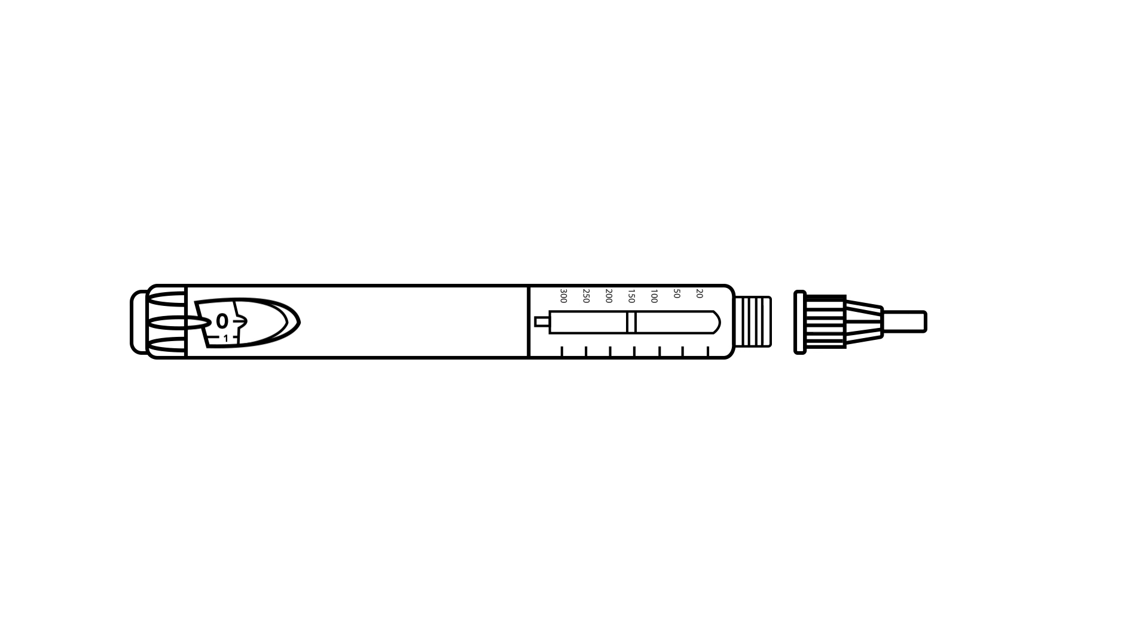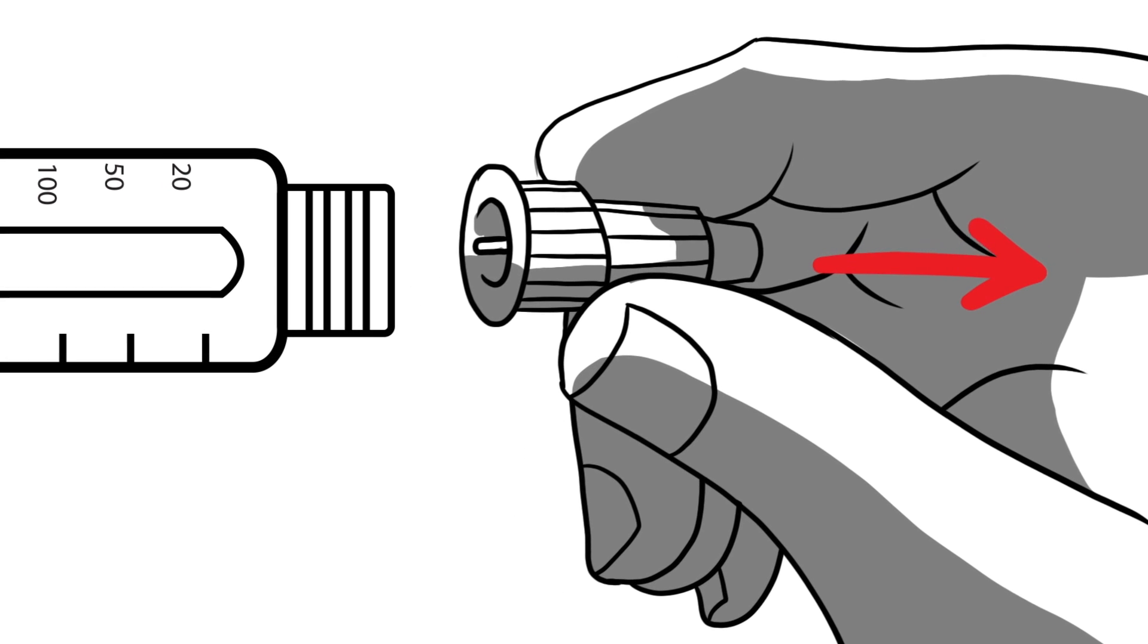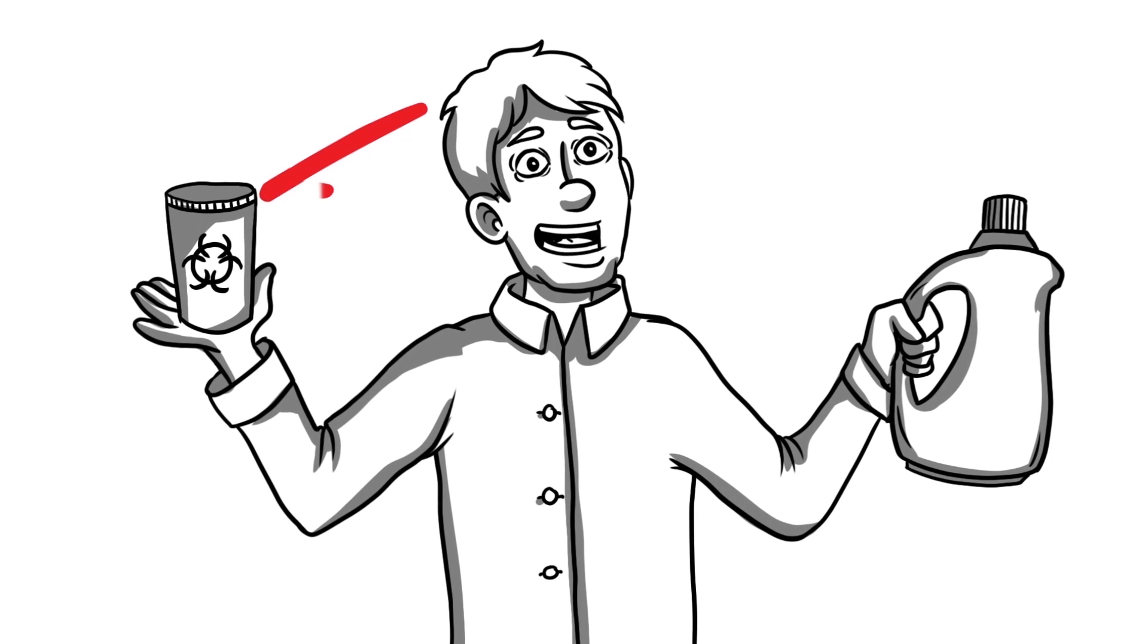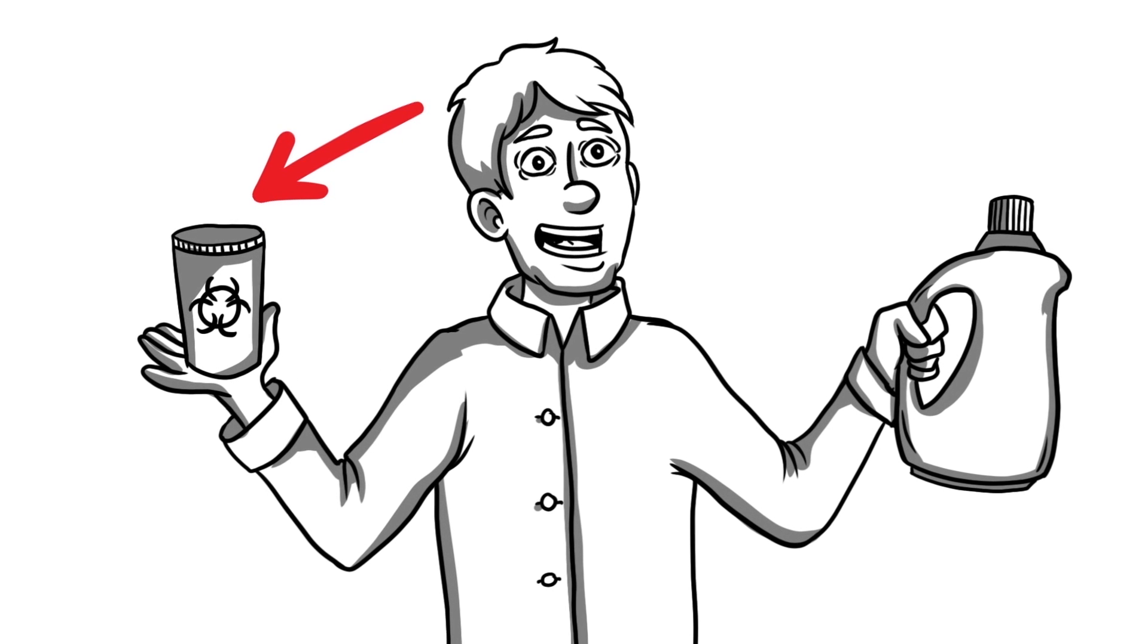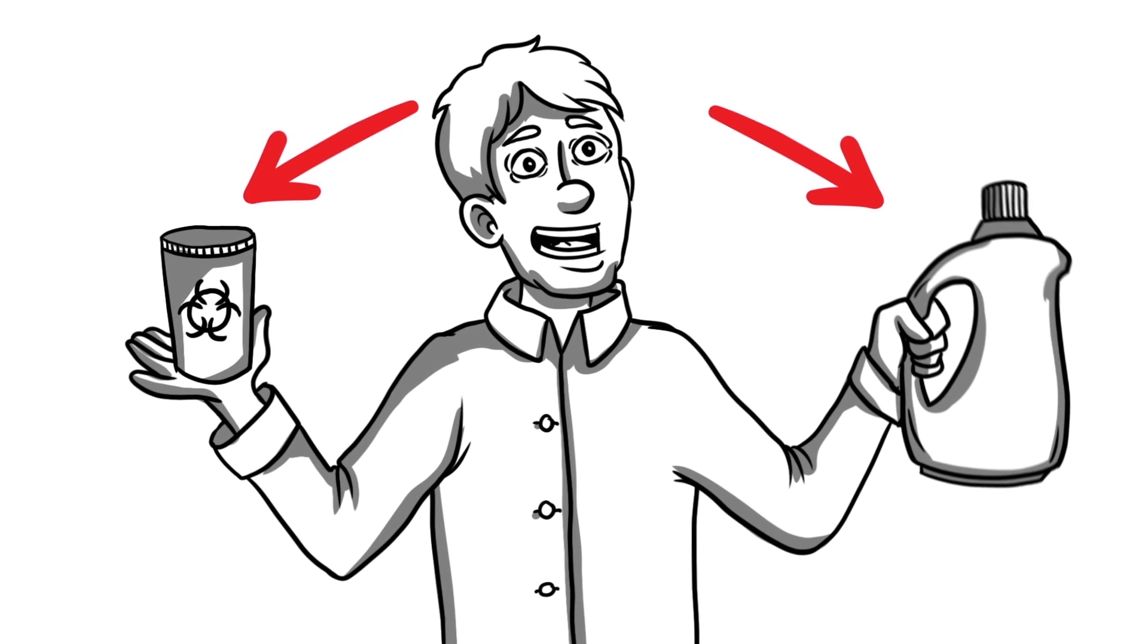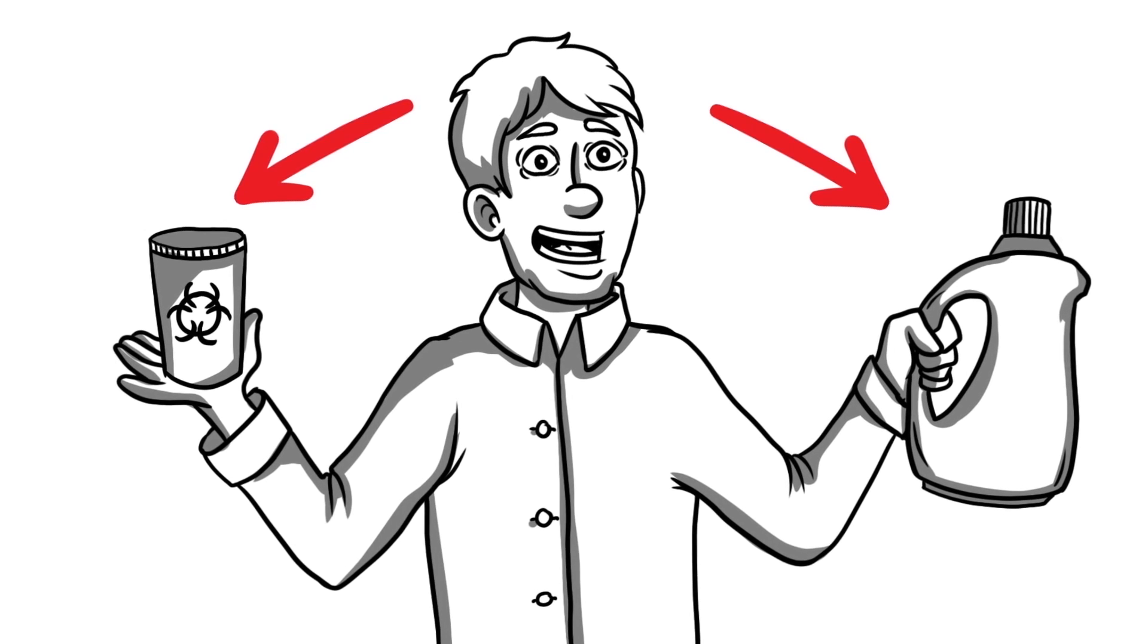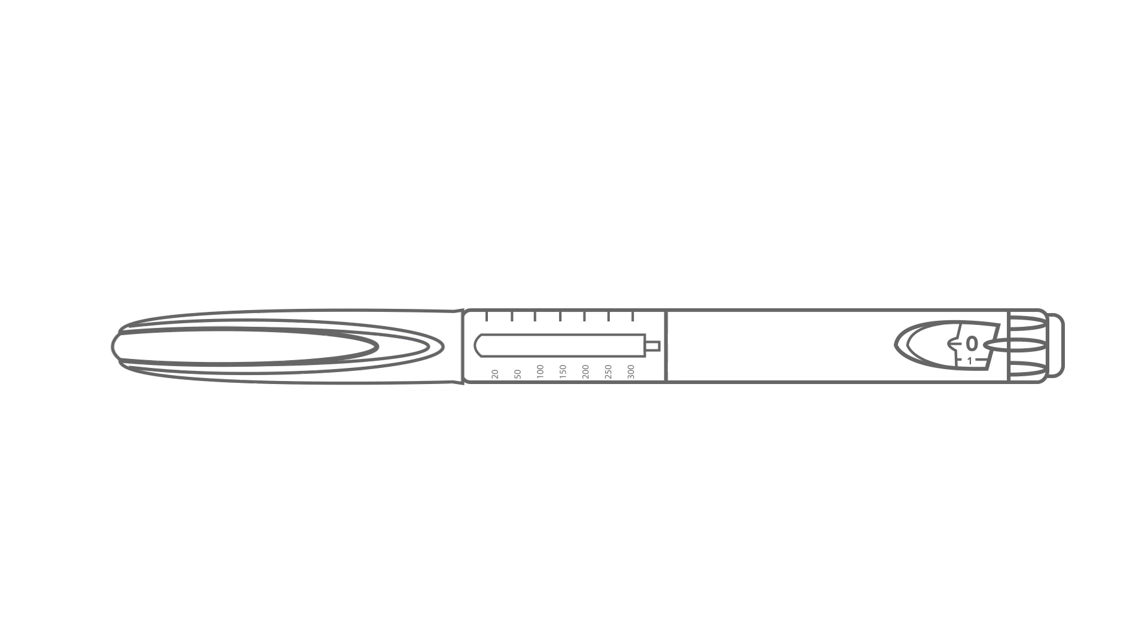The needle and cap should then easily lift off as one unit. The needle goes into the sharps container. If you do not have a sharps container, an appropriately labelled old laundry detergent bottle will do. A sharps container should be made of hard plastic and have a screw-on cap. Put the pen cap back on the insulin pen. Note, the needle should not be attached when you do this and store for the next party.